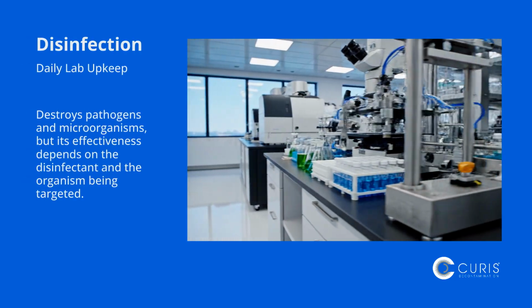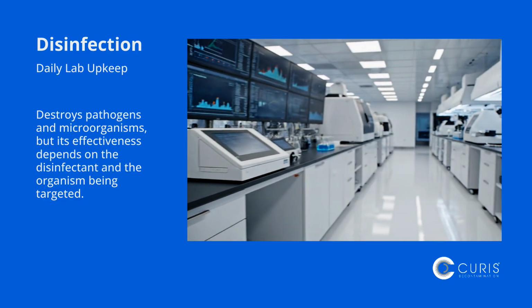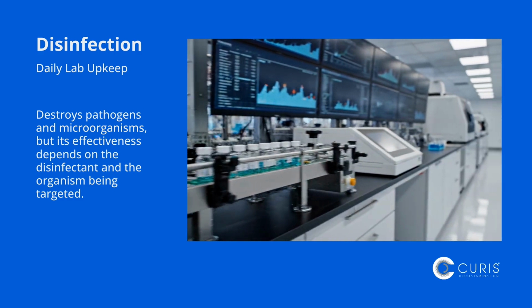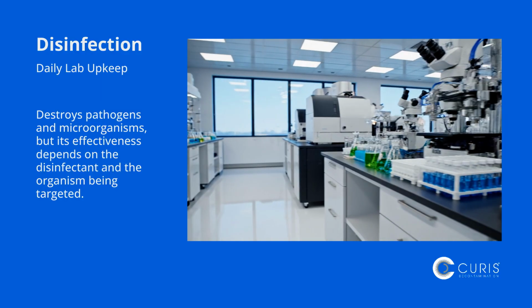Disinfection destroys pathogens and microorganisms, but its effectiveness depends on the disinfectant and the organism being targeted. It's the standard for daily lab upkeep, whether through sprays and wipes for high-touch surfaces or fumigation methods for whole-room biodecontamination.